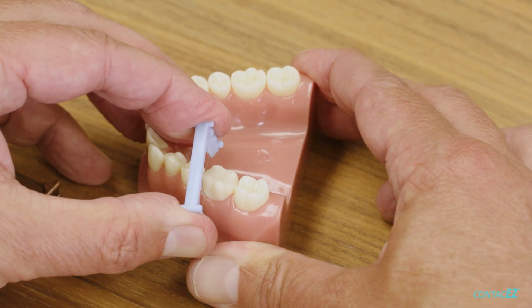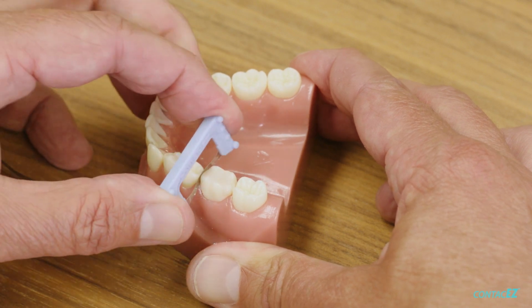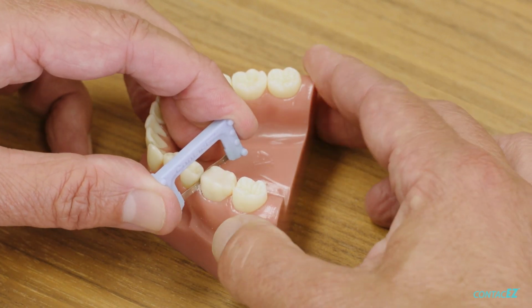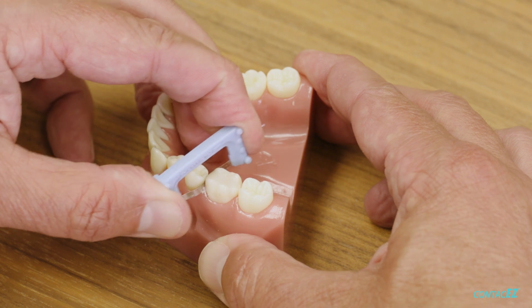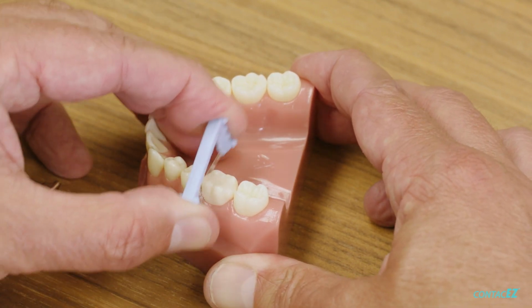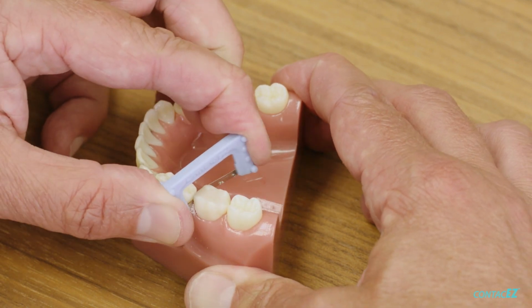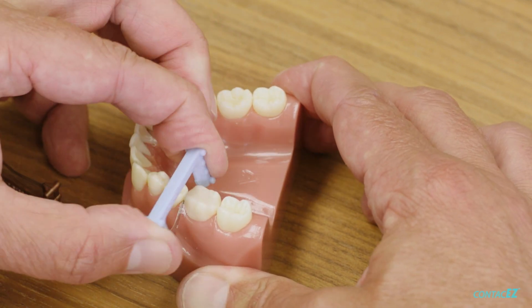Unlike on real gingiva, I don't think I'm going to be able to get far enough subgingival to cut with that upper portion. This material actually is more difficult to cut than human tissue, as you're probably aware. So I'm working my way using mainly that bottom portion of the cutting going back and forth. And it gets tighter whenever I turn it.